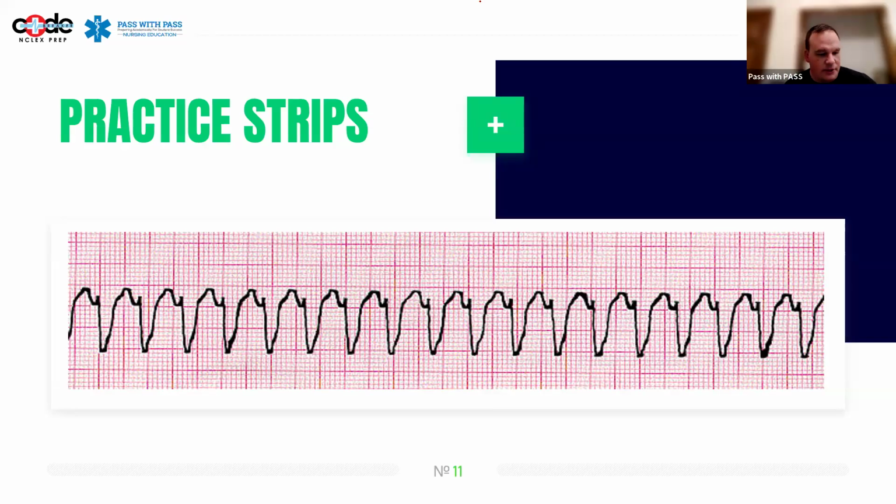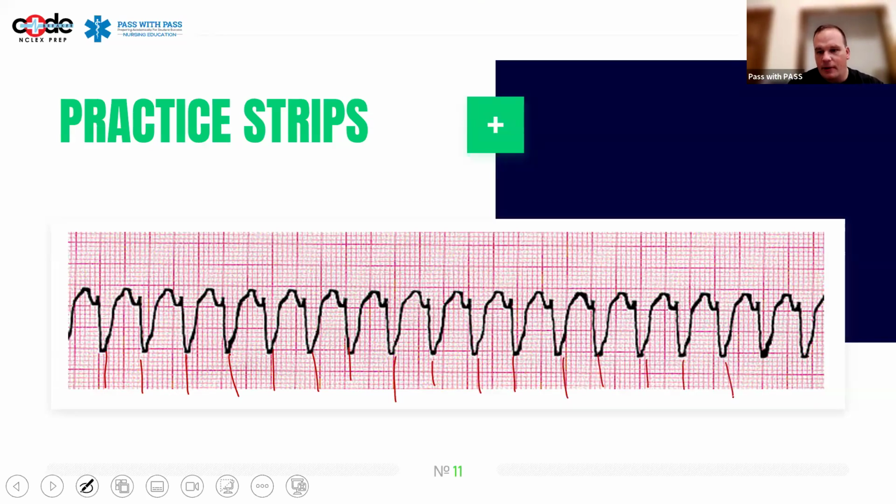And hopefully, as I was taking a drink of water, you were already saying it. Is it regular or not? As I mark out my R's, they all appear to be pretty evenly spaced to me. Yes, I'd say this is a regular rhythm.